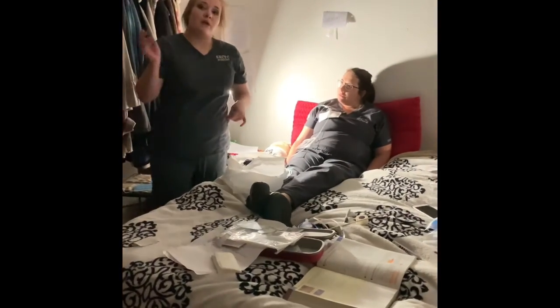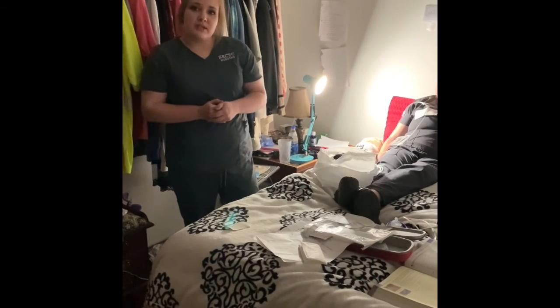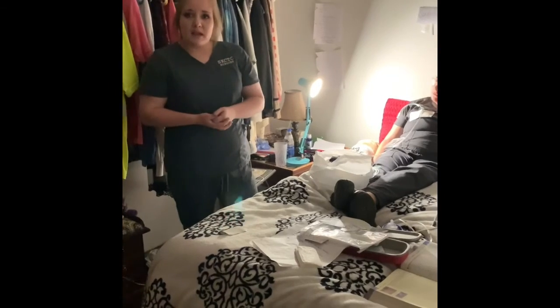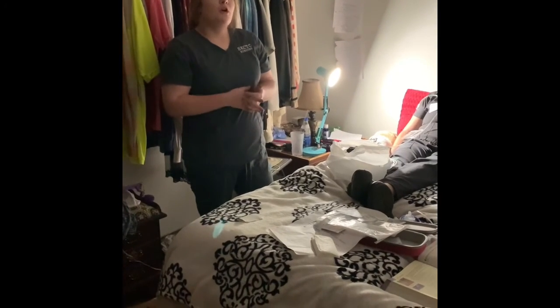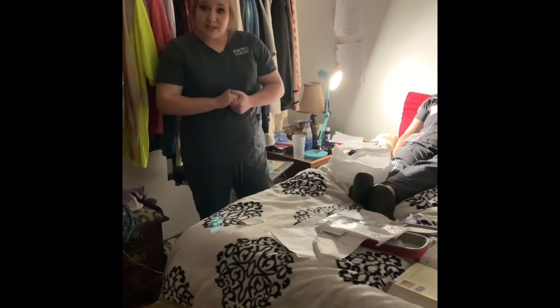Once that was done, I would make sure my hands were washed before leaving the room, and I would document the procedure. I would document how the patient took the procedure, equipment that I had used, any drainage present, any swelling, any pain, any discomfort, anything like that. Once that had been documented, then the procedure would be completed.